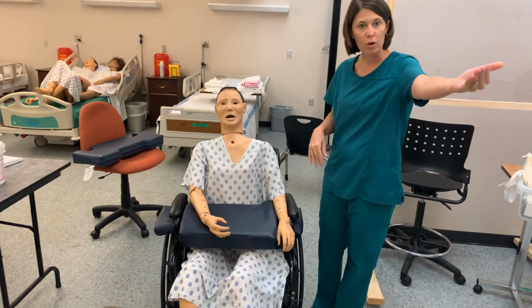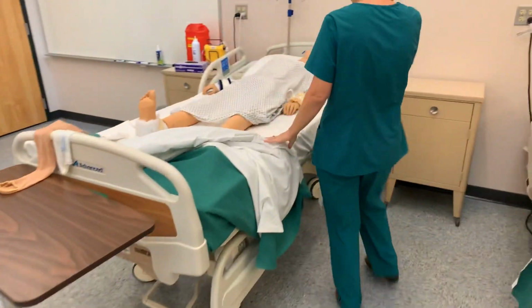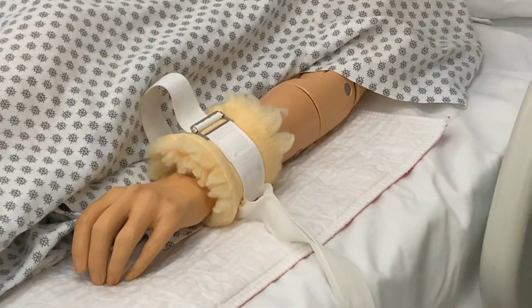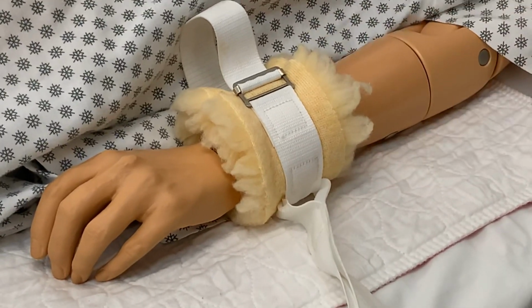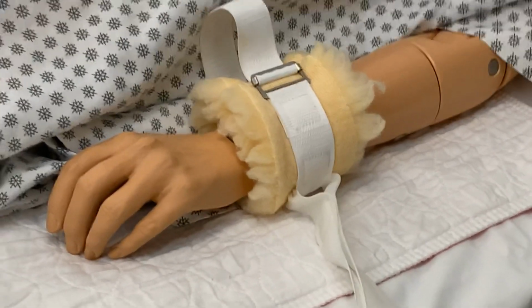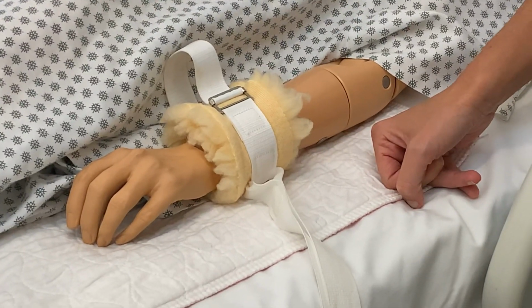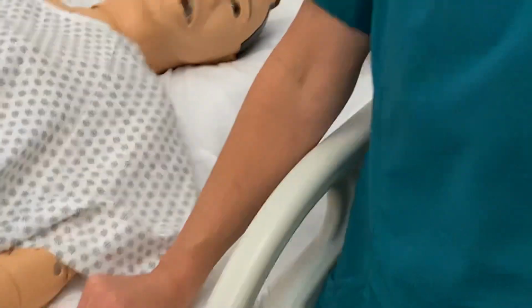So now I'd like to go over to our client that's in a bed here. This particular client, this is an example of a wrist restraint. This restraint actually could be used on the client's leg as well. So when do you typically see this? Well, it may be that this client had a feeding tube, or maybe they were on a ventilator, a breathing machine, and they had attempted to remove those tubes. Well, that could put the patient at harm. Maybe they're confused and they don't really understand what they're doing. So that's typically when you would use this type of protective device.